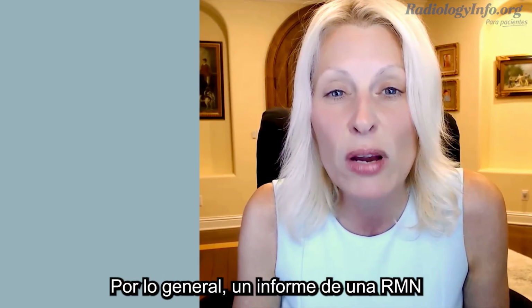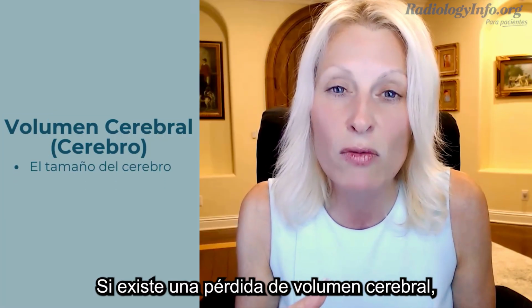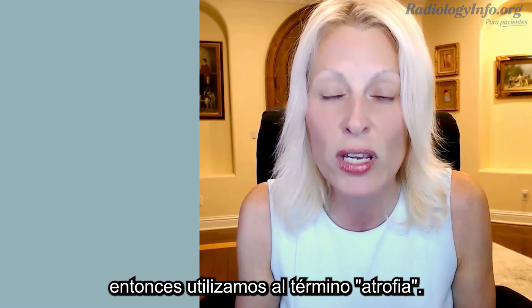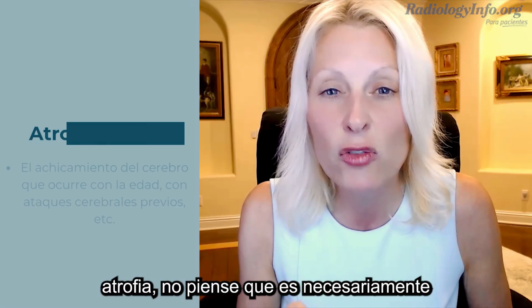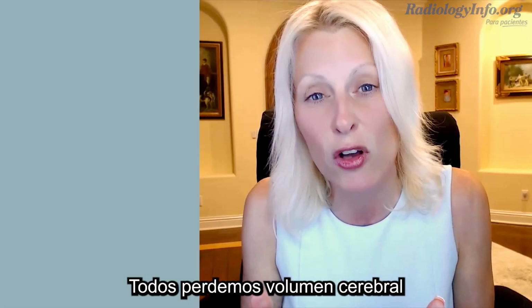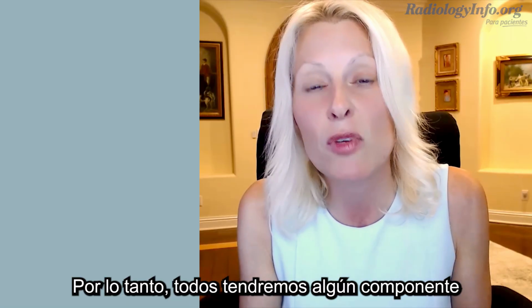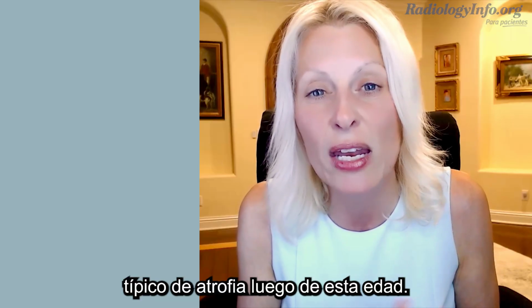Usually an MRI brain report will talk about your brain volume. If there is a loss of brain volume, we use the term atrophy. Just because you see the word atrophy, don't think that it's necessarily something wrong. Everyone actually loses brain volume after the age of 40, so everyone will typically have some component of atrophy after that age.